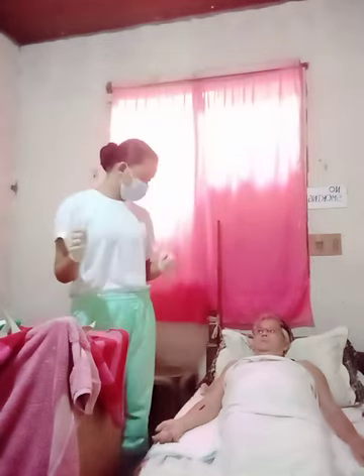Apply the dry sterile dressing to the incision or wound.